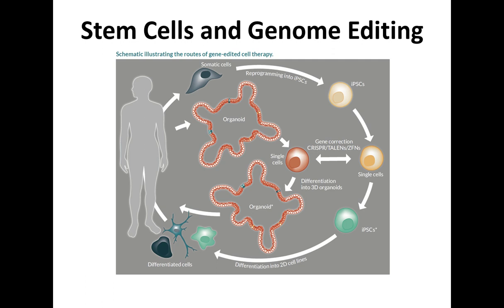We currently use Matrigel for most of the culture, and this is a material which is not fully defined, so it doesn't comply with the good manufacturing practice that we have to achieve for human therapy. If somebody figures out how to generate a synthetic material for organoid culture, I think this can be achieved in the near future.